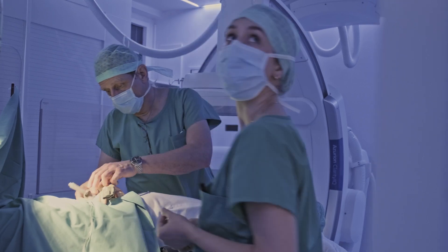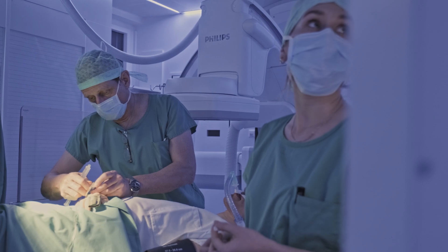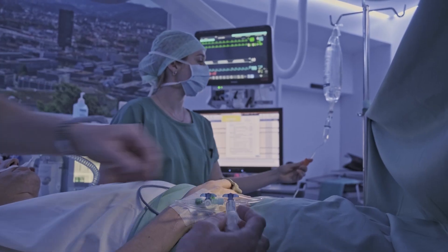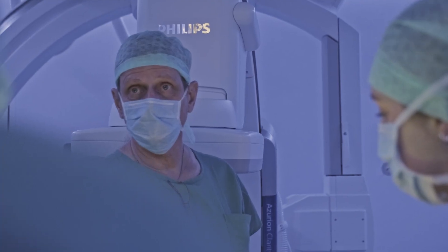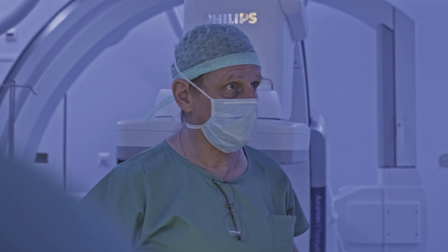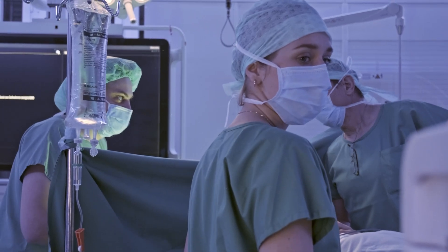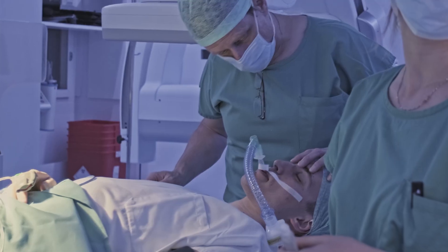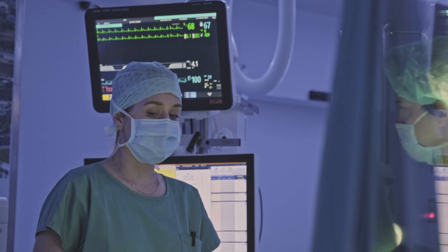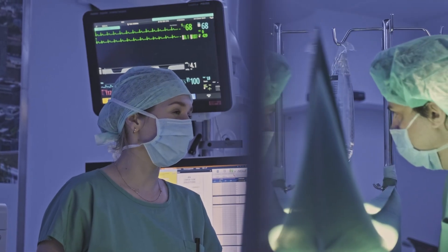Peripheral vision is also crucial for patient monitoring, particularly as anesthesiologists only spend 5% of the time during an operation looking at the numbers. By giving the anesthesiologists a visual image-based representation, they gain heightened situational awareness, allowing them to make informed choices. With this overview in place, they can focus on observing patients, interacting with colleagues, and managing the devices used during the procedure.